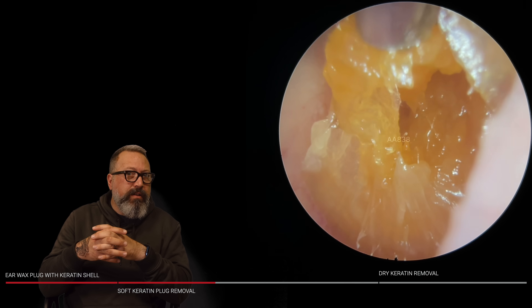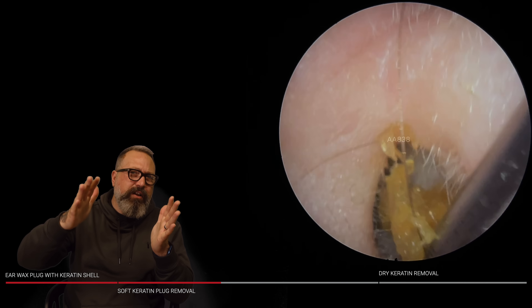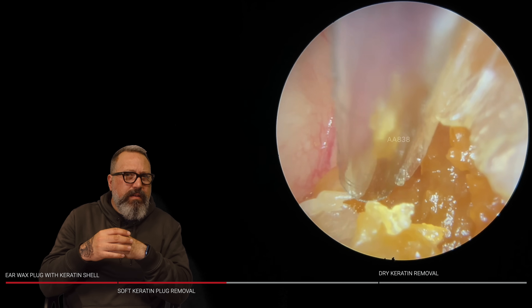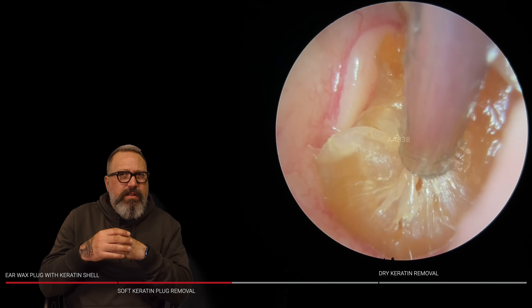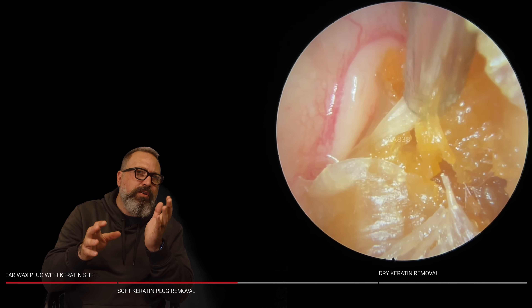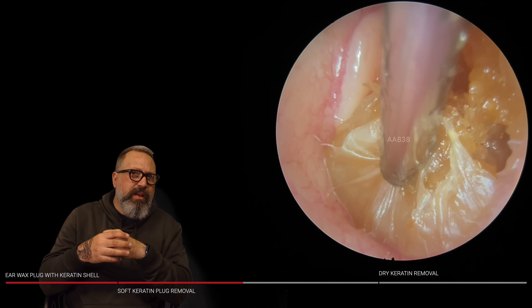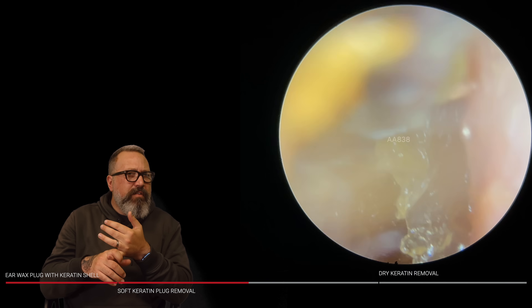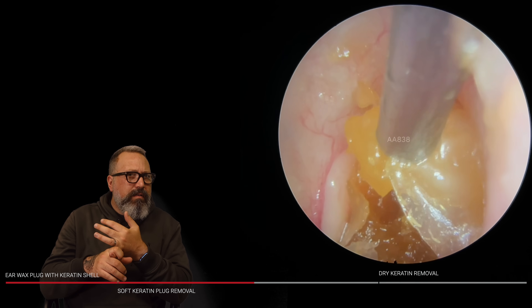It's working its way down the canal. Look at that keratin section there — you can see almost that sort of concertina effect where it kind of just came away and lifted in layers as it came to the other part of the ear canal. We've got that lighter coloured material with that deep red around it on your top left. It wouldn't surprise me if this patient's had some surgery to their ear canals — that almost looks like a bit of scar tissue, which might well account for why this skin isn't migrating out the way it should. We may be looking at a patient with a previous tympanoplasty.